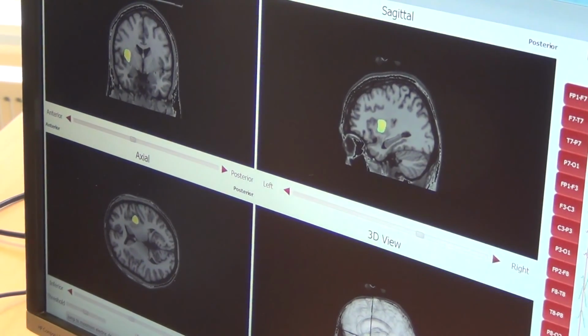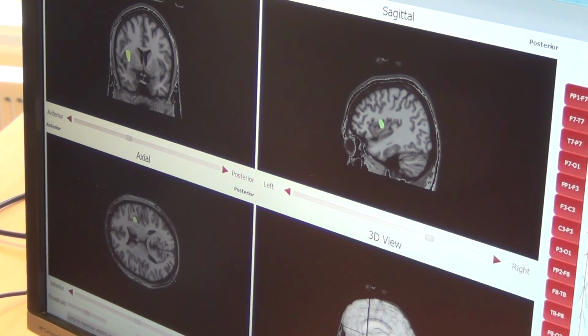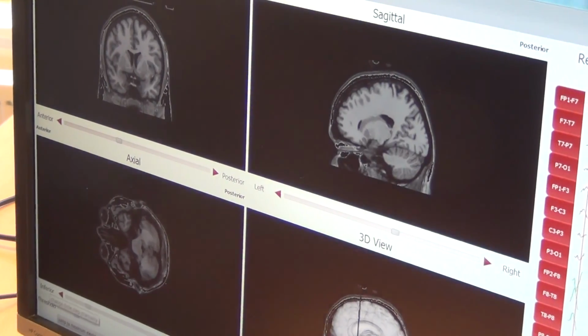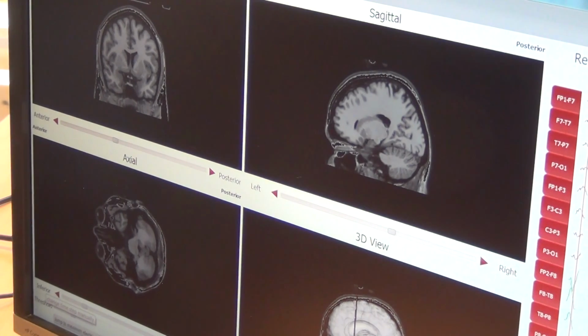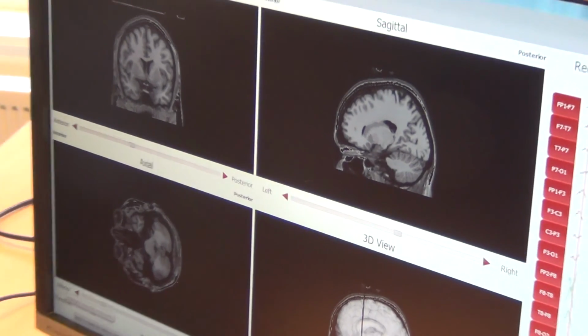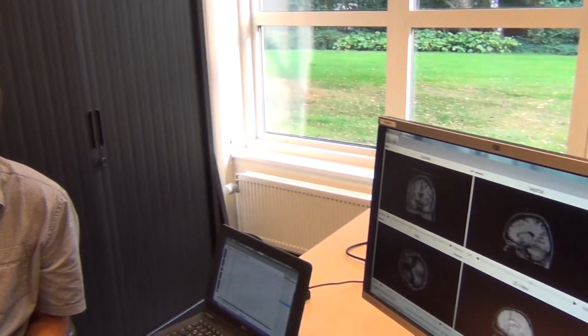I see. Can you also have an epileptic event in one cluster creating an epileptic event in another cluster, and can you detect whether that is actually occurring by correlating in time? I did not understand.